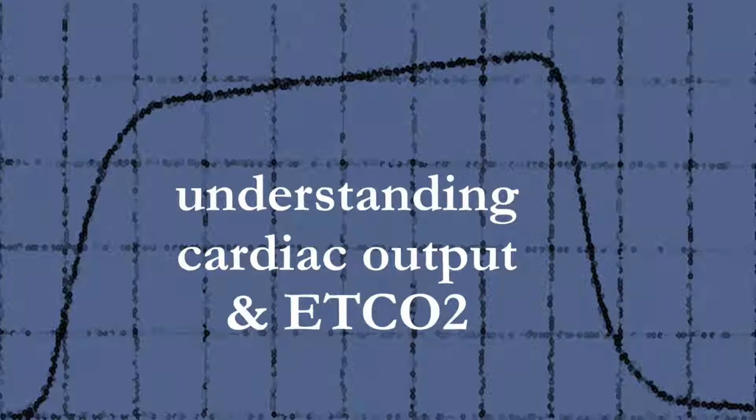the end tidal only reflect cardiac output when that cardiac output is dynamic. If the cardiac output is fairly stable, then what you're seeing in the end tidal is really more of a reflection of gas exchange. The important thing to know about cardiac output and end tidal changes, especially as we're about to talk about CPR, is as the cardiac output drops, the tissues are really good at sequestering CO2 and holding on to CO2 as the cardiac output drops. So as cardiac output increases, you'll expect to see a rise in the end tidal CO2, at least transiently.